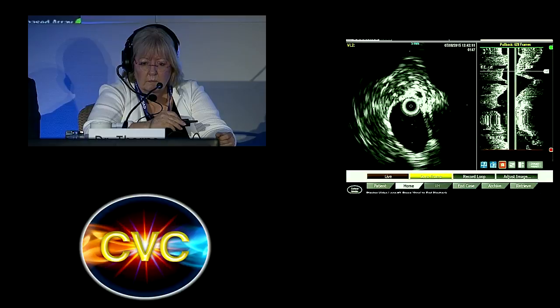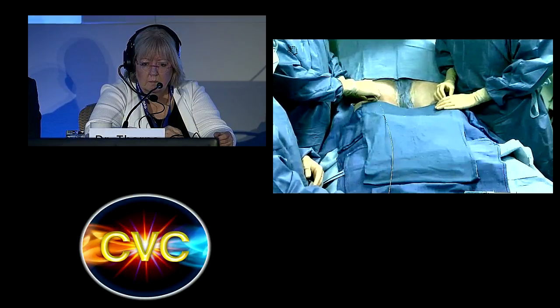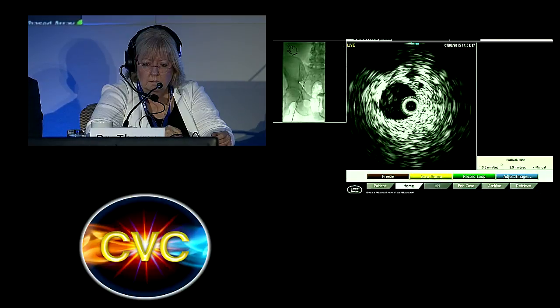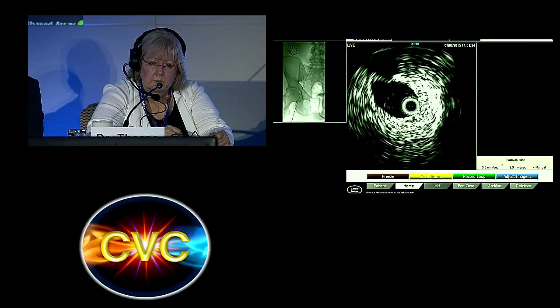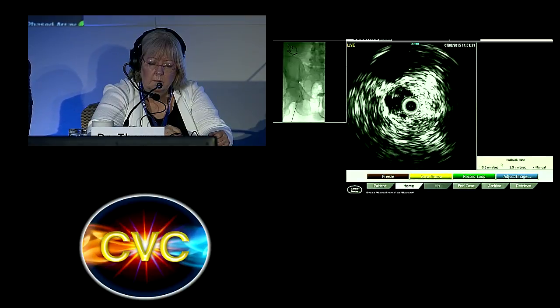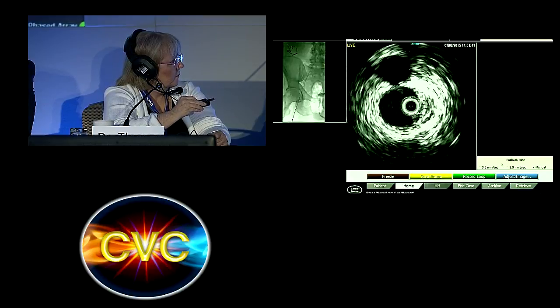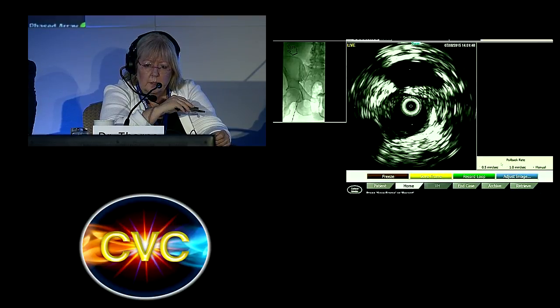Now, we're in the process of repeating the IVUS just to look at that area again. So let's just look at that live. If you hold the wire back there. So you can see even with the IVUS, the superficial femoral vein looks actually pretty clean. And this is just the external iliac vein coming back in retrograde manner. We're now crossing this area in particular, and you can see, Dr. Thorpe, it narrows some, and there's some fibrosis or old thrombotic material in that area. It's just a very short distance, though, and then opens very big to that area below on the superficial femoral vein.